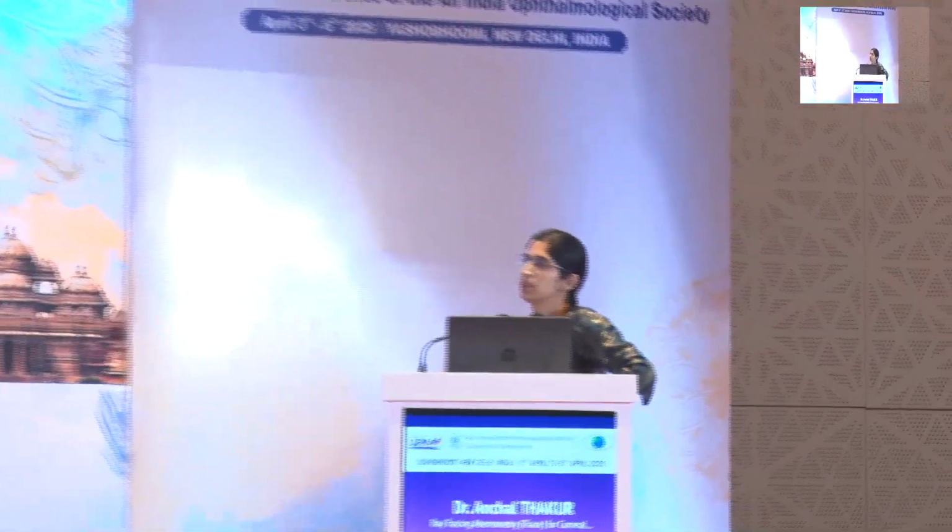This is a very good question. The subjective depth of focus is actually more than the objective depth of focus which the eye trace gives us. So even if we plan according to the eye trace, we'll end up landing a more continuous range of vision, because the subjective depth of focus will be much larger than what the eye trace is showing us. But definitely we can plan it, because objectification can be done using the eye trace.